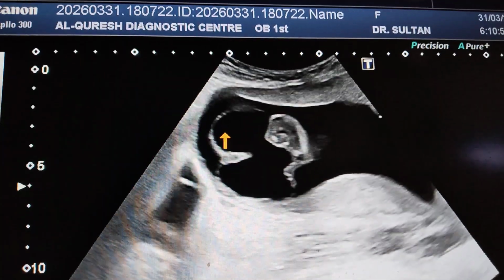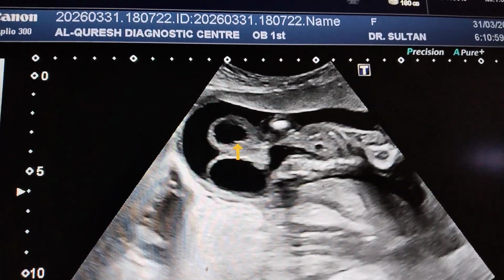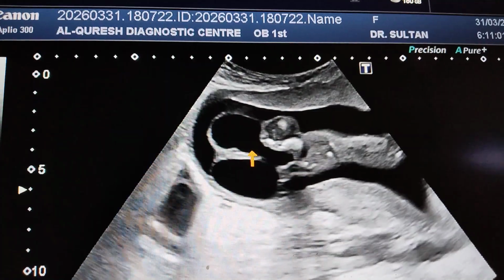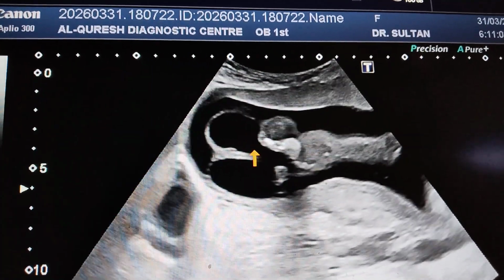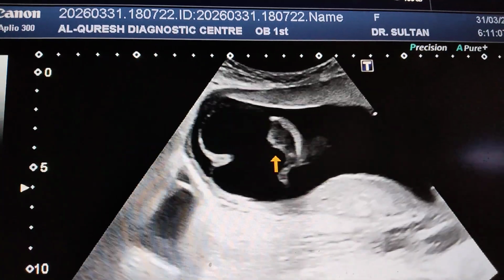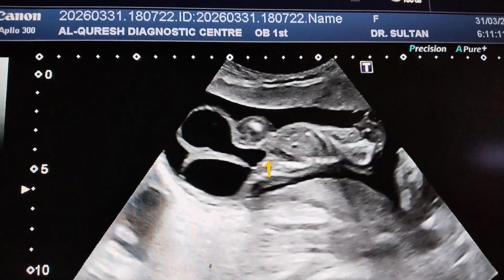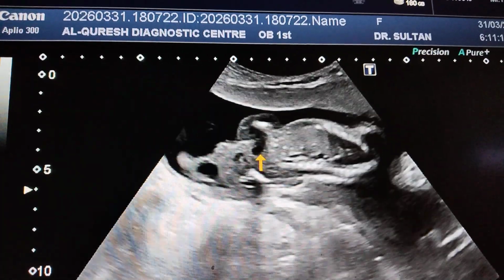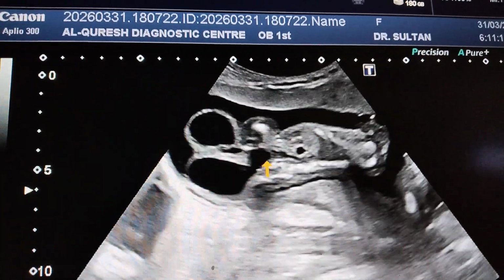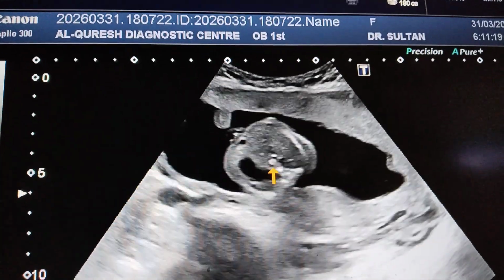This lesion is originating from the pelvic area, and it is extending inside the fetus through the pelvic region, and it is covering the pelvic area. This is the urinary bladder, and this is the pelvic area, and this is the abdomen.